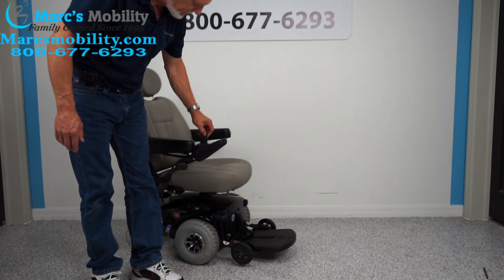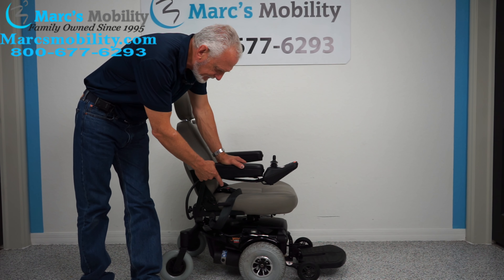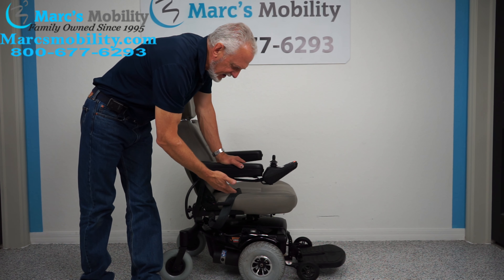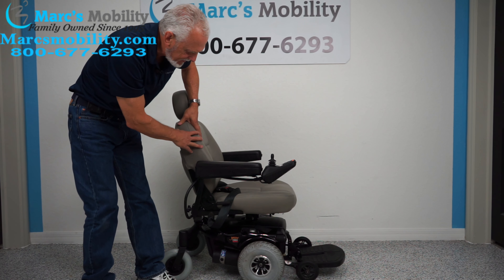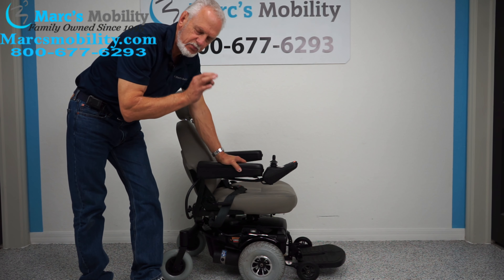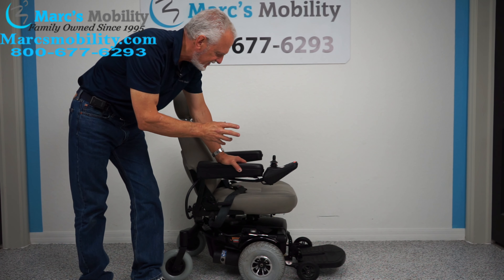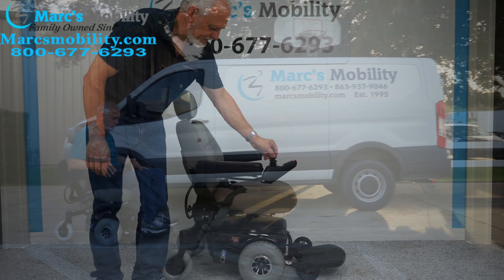You can't push the chair while it's in gear. To put it in neutral, turn the power off and then there's a handle on top of each motor. When you pull that handle out, the chair goes into neutral. You have to do both motors, then you can roll the chair around. When you're done, put it back in gear and turn the power back on.